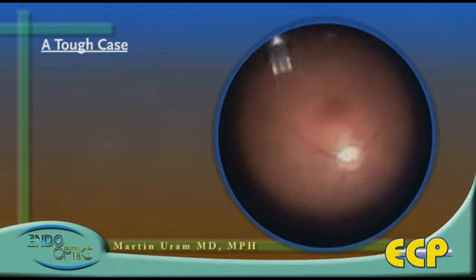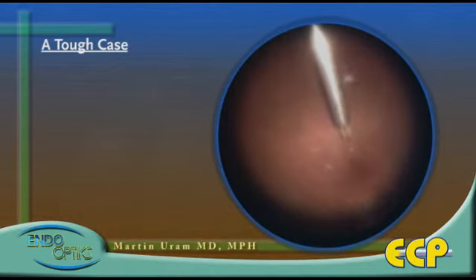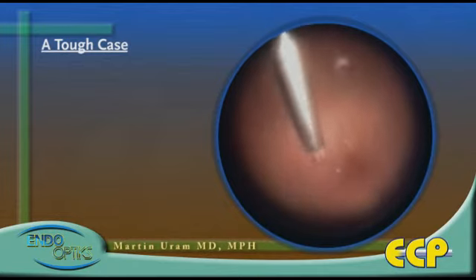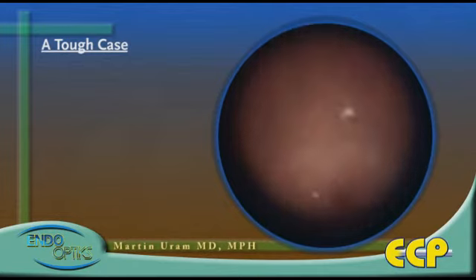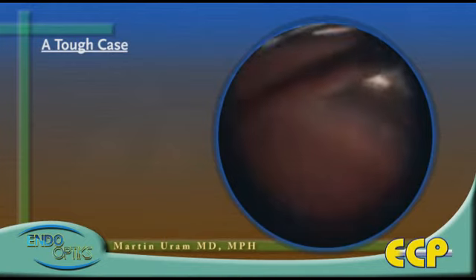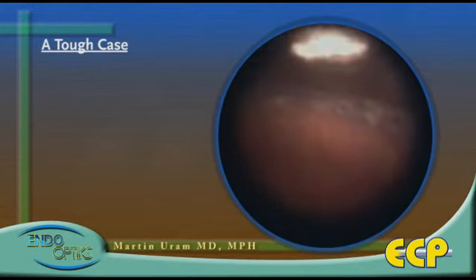So at this point, the glaucoma has been treated, the optic has been removed from the eye, the perfluorocarbon liquid has been removed, and all that needs to be done is to close the surgical wounds and inject some of the intraocular Decadron. Well, we hope you enjoyed that.